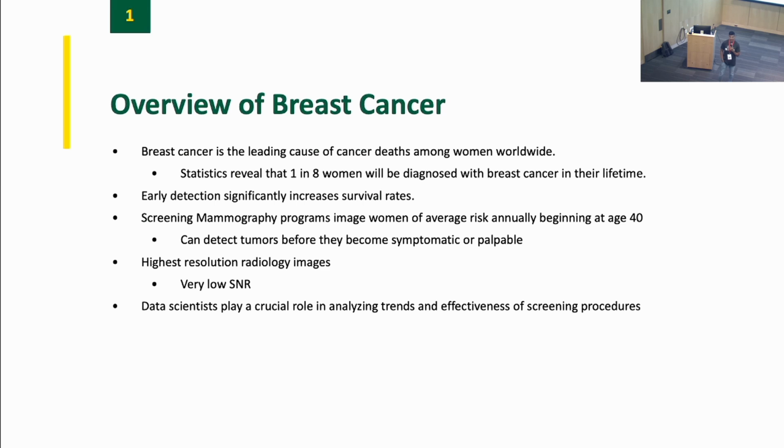This is a true needle in the haystack problem. So screening mammography screens 40 million women in the US every year, of which less than 1% have cancer. Of those women that have cancer, the cancer is present in one of the breasts, typically not both, so half again. And then of that 8 to 10 megapixel image, your cancer or ability to detect the cancer can be as few as 10, 20, 50, 100 pixels, right, out of 12 megapixels.